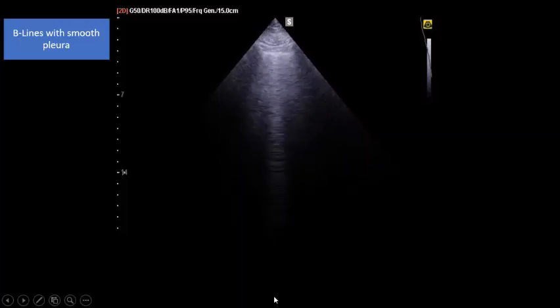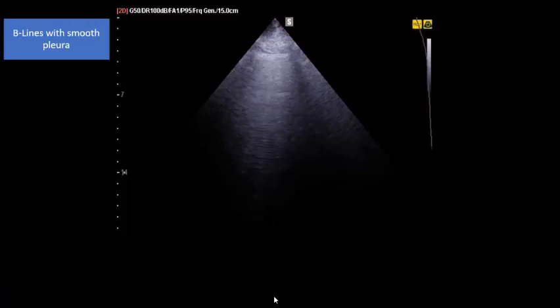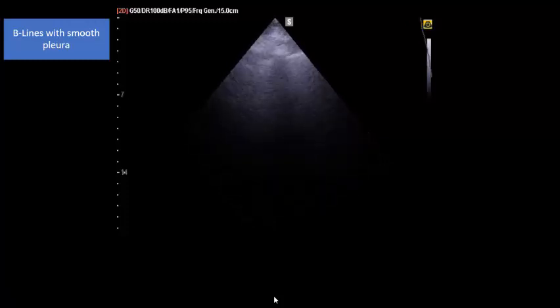And as you see, there are a lot of B-lines.